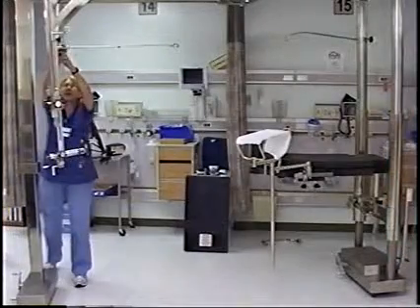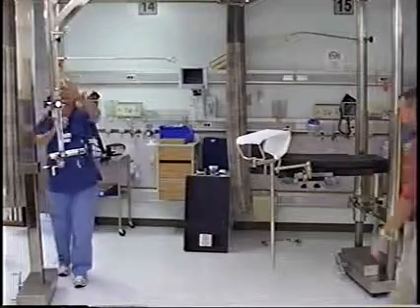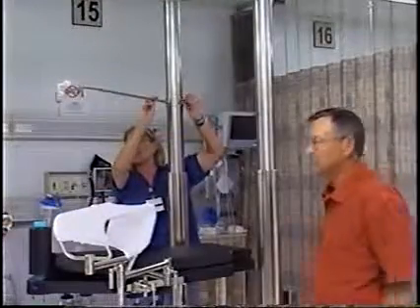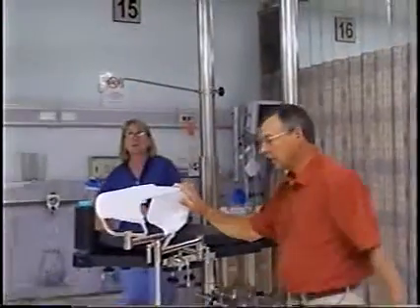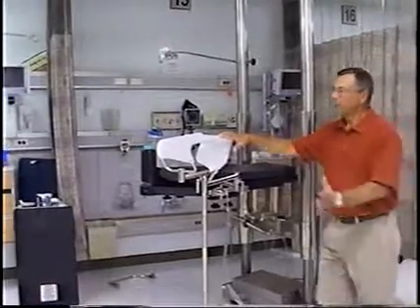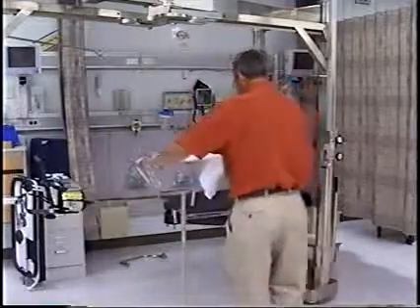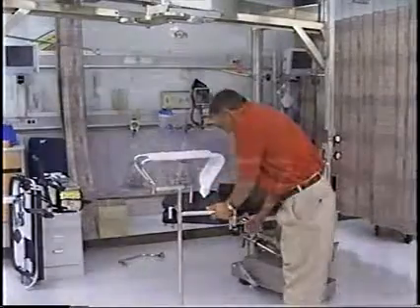And then if it's up this high, you can adjust these down. Take it down, take it up. And this one, I'm pretty tall, I can do this. But in order to get it even. Okay, anybody else want to go through this, or are you comfortable with it? It would be my recommendation that you keep the table set up in that configuration.